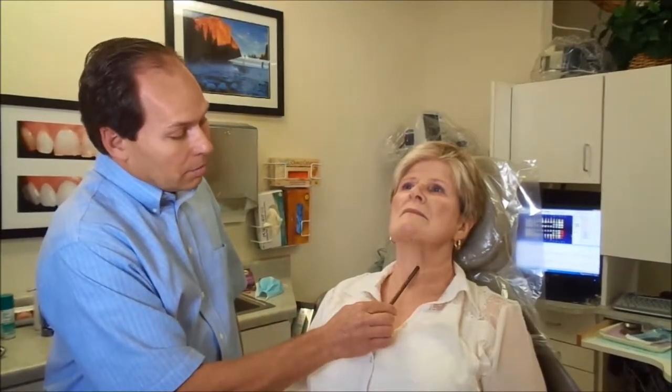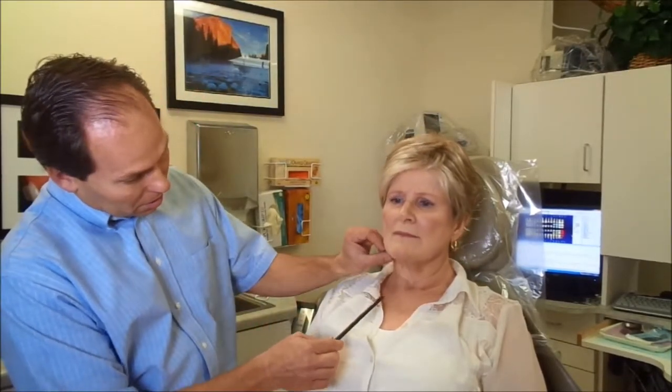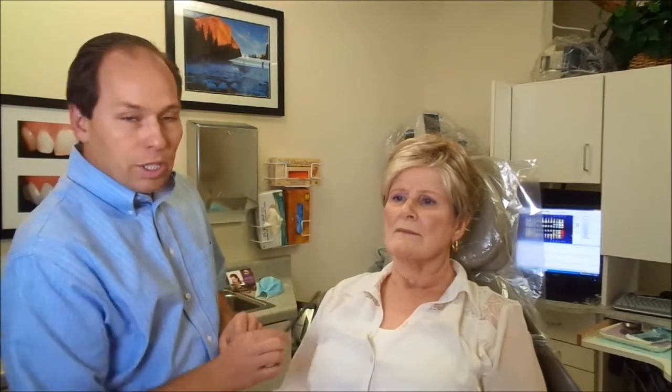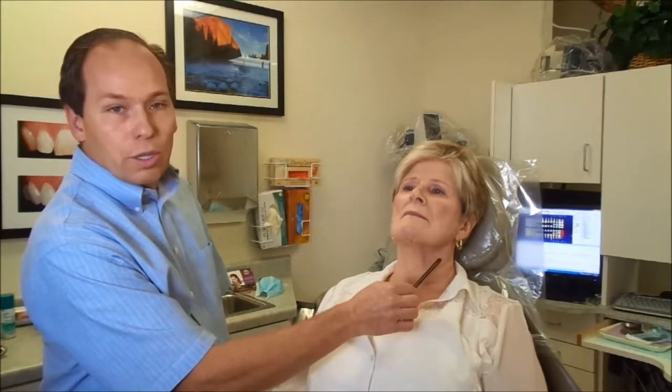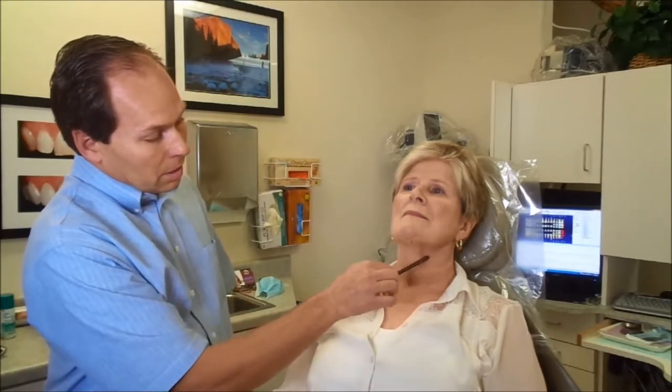I've marked this area right here with these dots — that's where we're going to place the Kybella. As she tips her head forward, we can see there's this little extra tissue right there that we're going to address with Kybella. We've also marked where we're going to start with our lifting threads, running them horizontally in this direction so that they pull the tissue back.